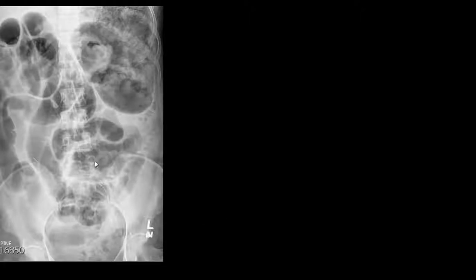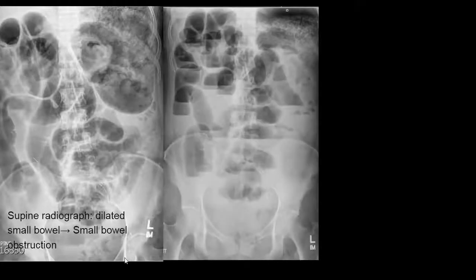In contrast to some of the normal radiographs we've seen, this one is abnormal. There's small bowel dilatation throughout the abdomen, which is highly concerning for small bowel obstruction. In these cases the next study of choice is a CT abdomen and pelvis.